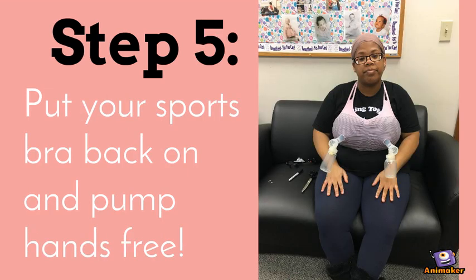And finally, put your sports bra back on, attach the tubing from your pump, and now you can pump hands-free.